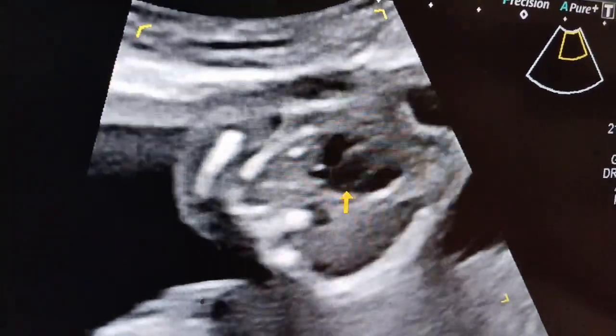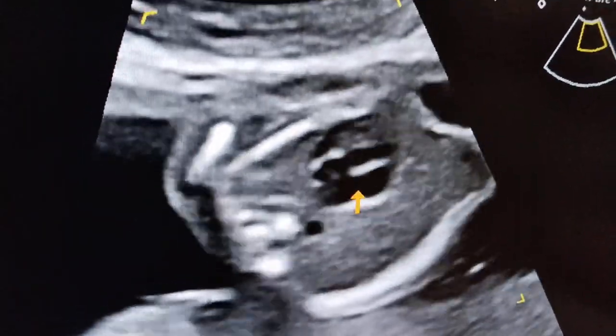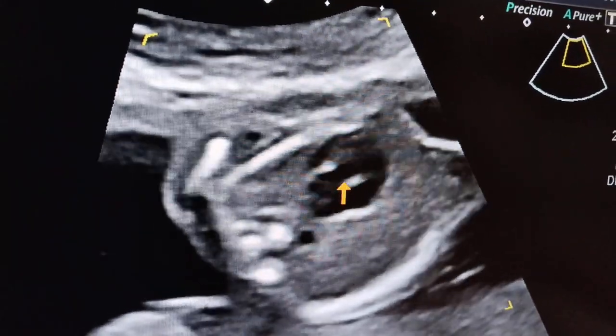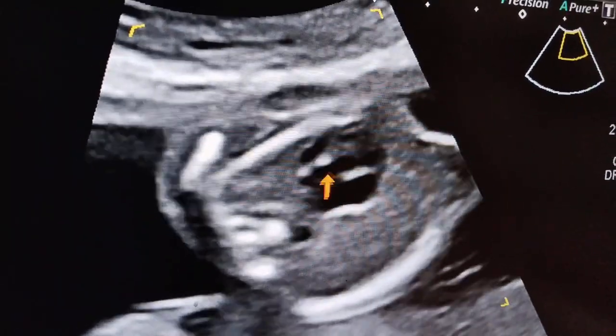So this is one finding we have seen, that the fetal heart is displaced toward the extreme left side.